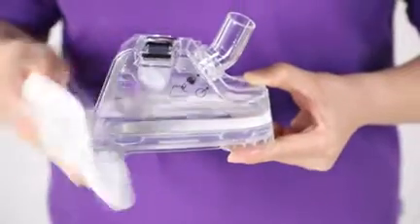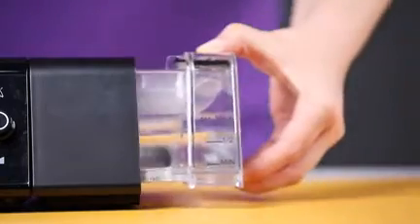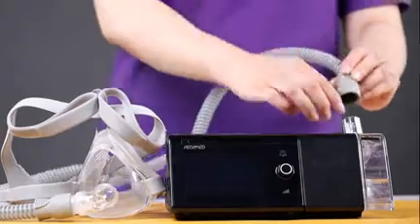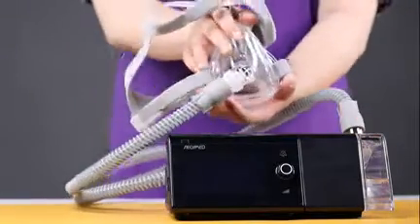Make sure to dry the shell of the tank before inserting. Then hold the press button to reinstall the water tank. Connect the tubing to the air outlet. Now you may start to use the NeoBiP.